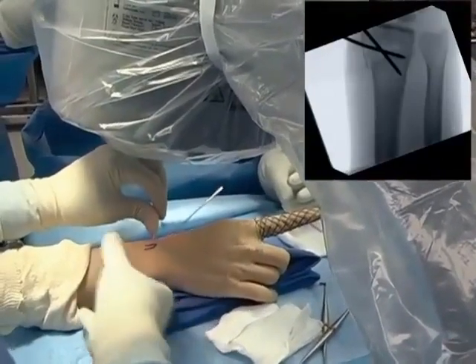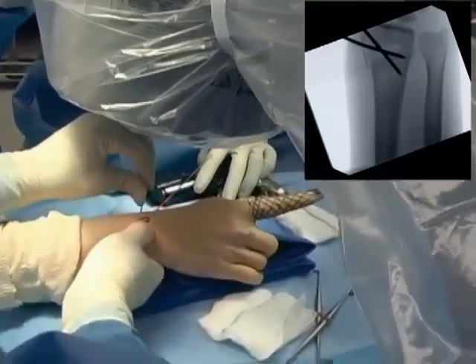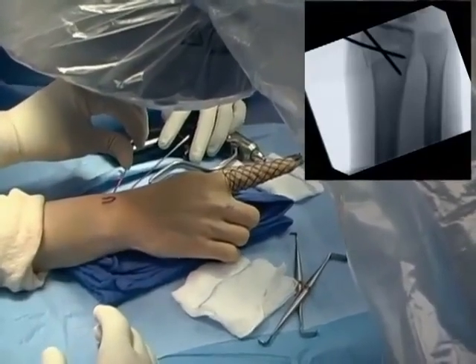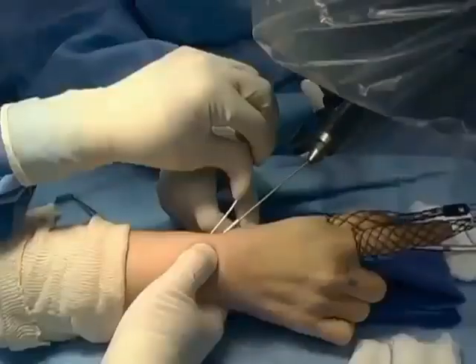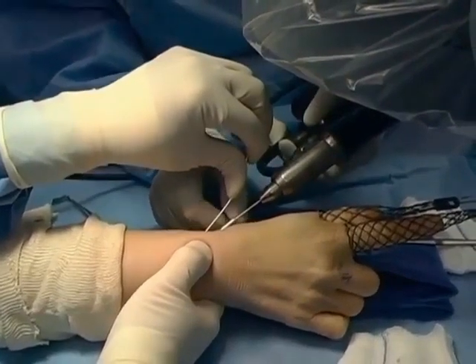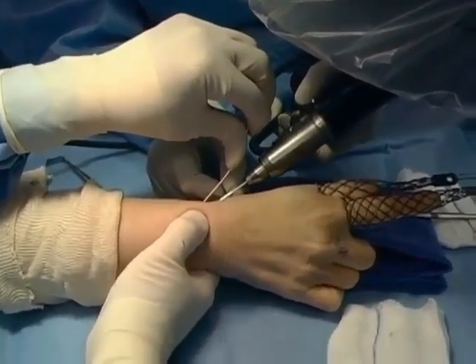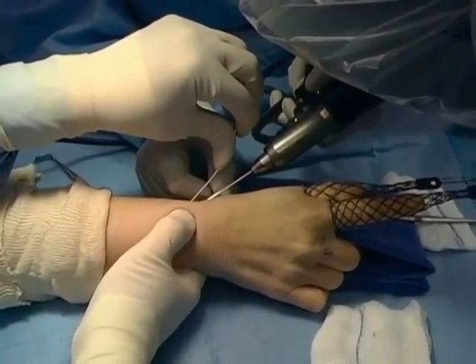The radial styloid pin is then driven across the fracture into the opposite cortex of the radius proximal to the fracture line. It is embedded into the cortex and may be driven just beyond the cortex, but only about a millimeter or so. Here the pin is being driven across the fracture engaging the opposite cortex, which effectively stabilizes the fracture.